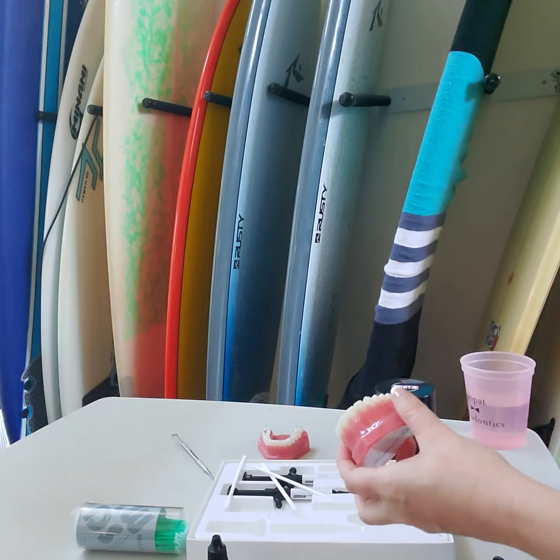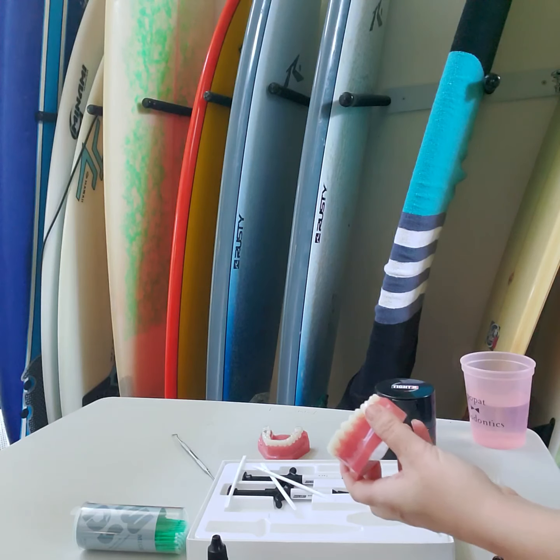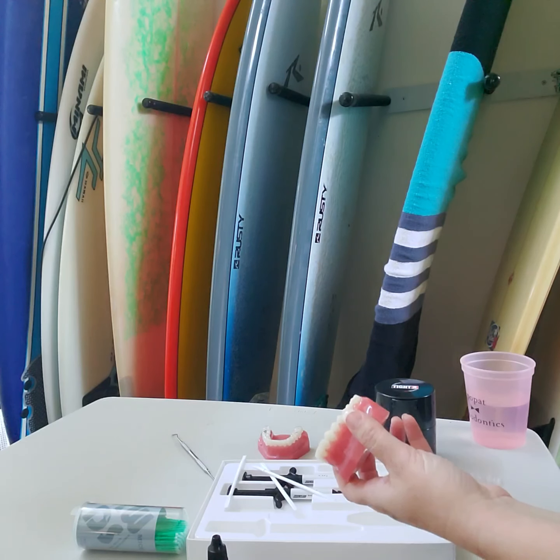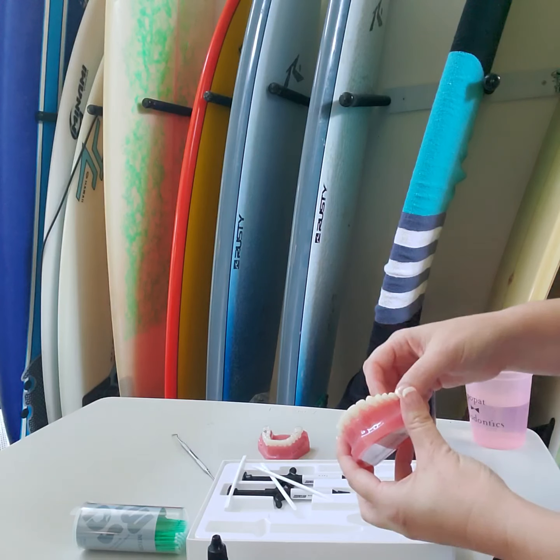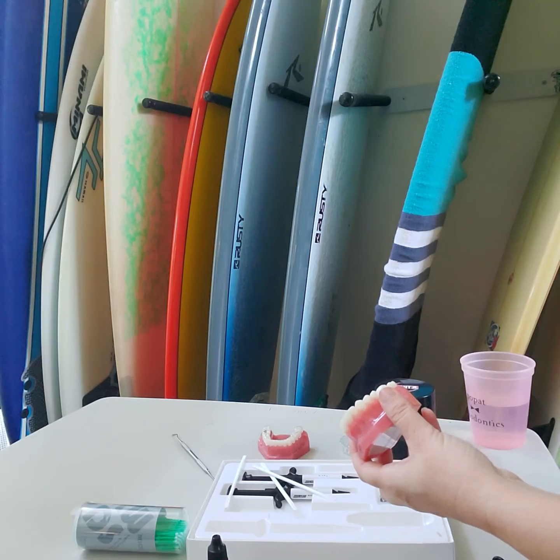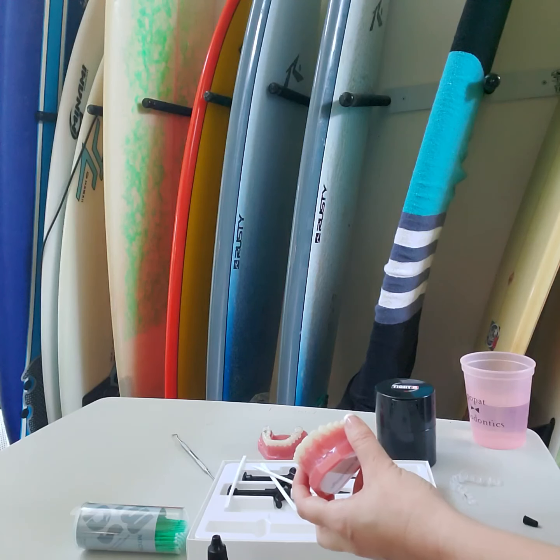Because one of the biggest errors that people get, number one, is that they forgot to etch a certain area. Well, it's not going to stay on if you didn't etch it, right? We also don't want to etch the whole tooth because that's taking off a layer of enamel and making it more weak. So let's just etch the areas that are important.